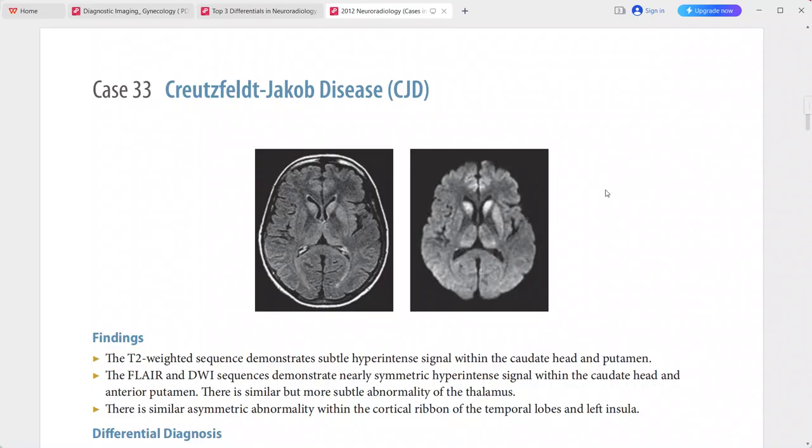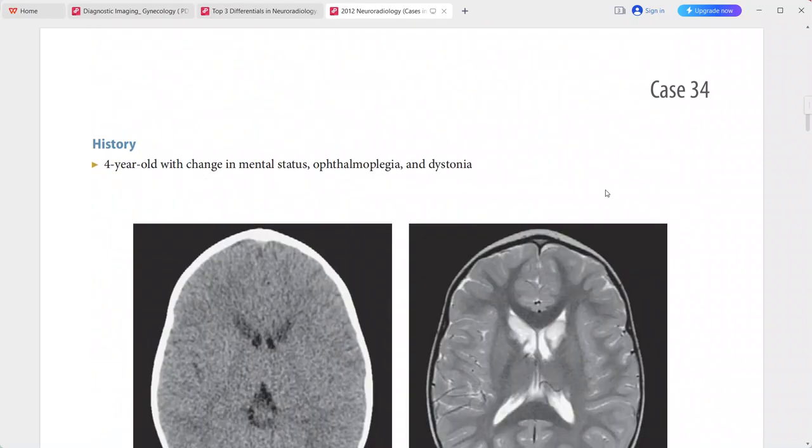Differentials include paraneoplastic encephalitis, hypoxic-ischemic encephalopathy, and Leigh disease.